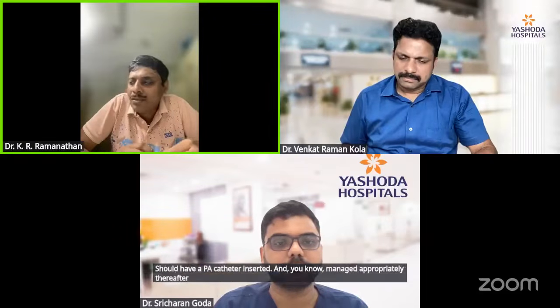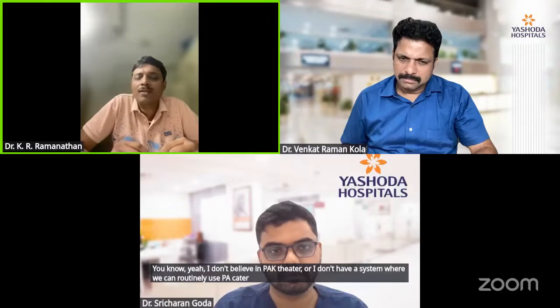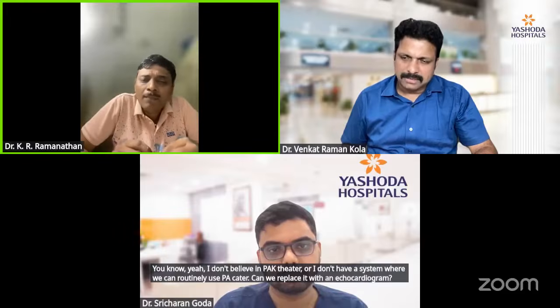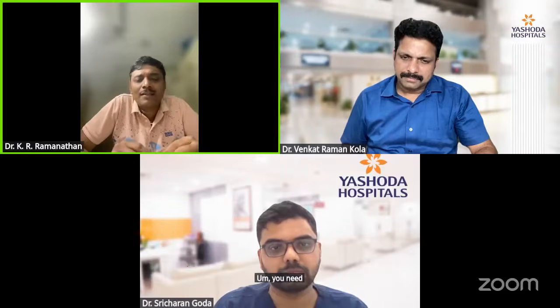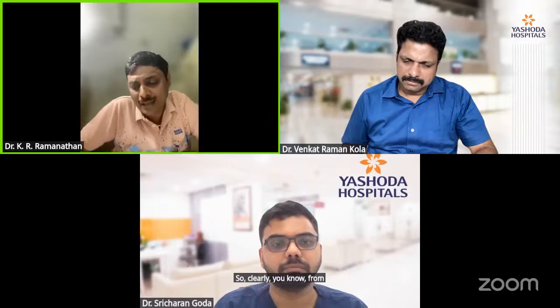Now the question comes: what if I don't believe in the PA catheter, or I don't have a system where we can routinely use one? Can we replace it with an echocardiogram? You need technical finesse to interpret an echocardiogram in this context and to calculate wedge pressures and other things using echo.